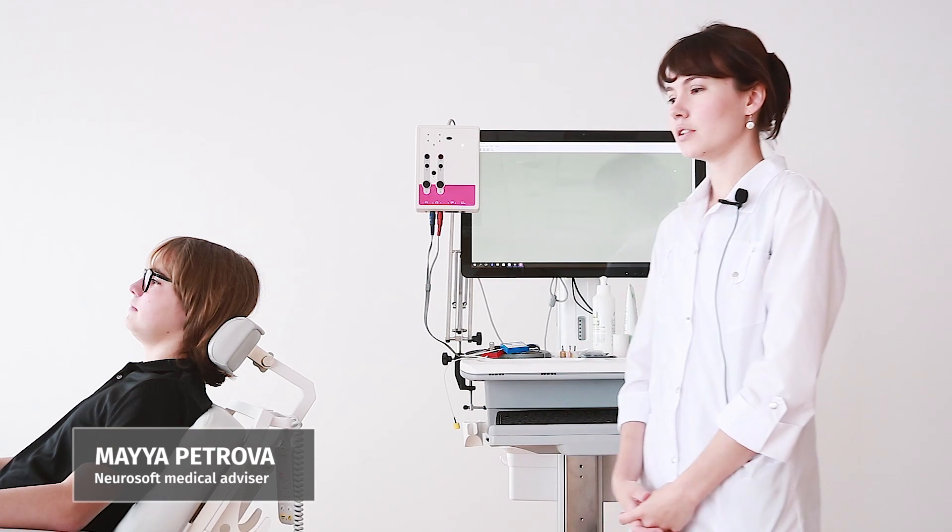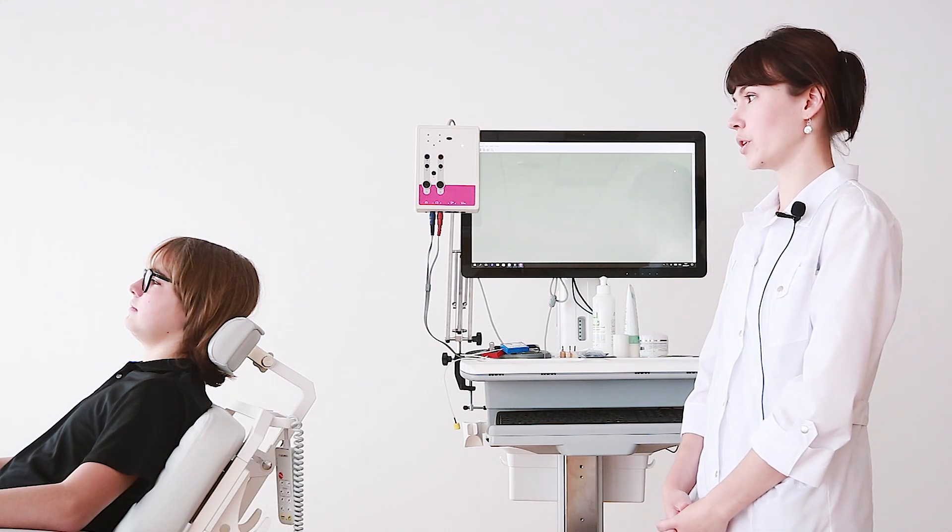Let's perform the electrocochleography test. This test allows us to evaluate the state of the cochlea and the initial part of the auditory nerve for our patient.